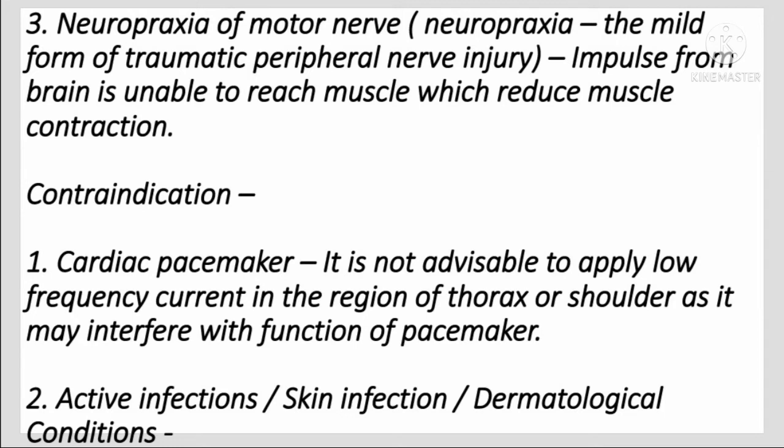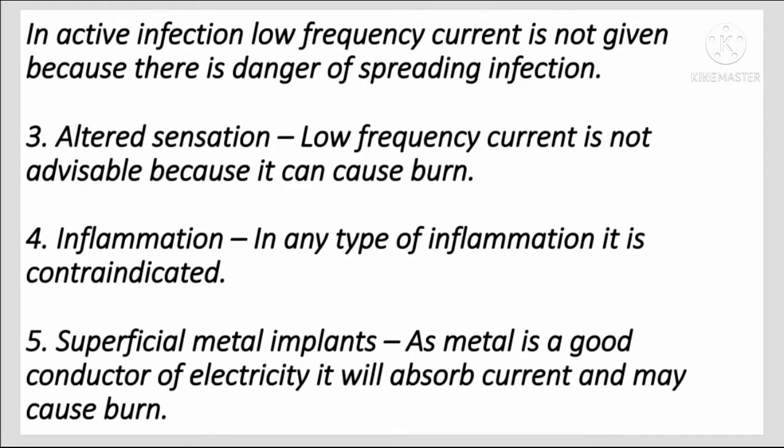Contraindication, cardiac pacemaker. It is not advisable to apply the low frequency current in the region of thorax or shoulder as it may interfere in the function of the pacemaker. Active infection or skin infection or dermatological condition. In active infection, low frequency current is not given because there is a danger of spreading infection. Altered sensation. Low frequency current is not advisable because it can cause burn. Inflammation. In any type of inflammation, it is contraindicated.